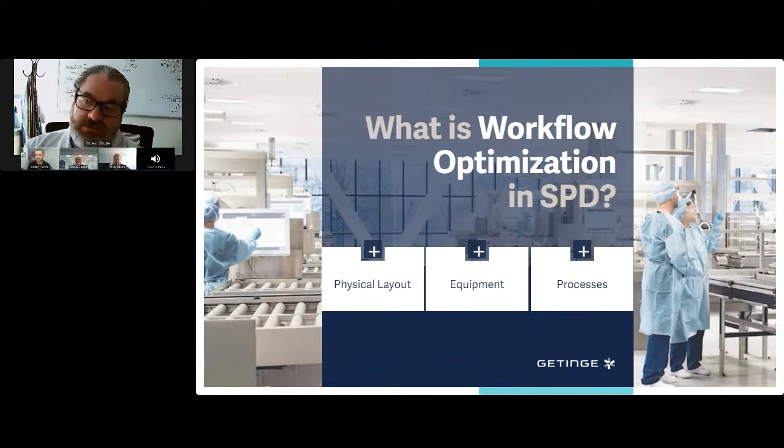So some of the ways we can do that: standard operating procedures, visual workplace, making sure those connections are clear, that we have feedback loops, and when something is sent, that we're also providing that information. And then lastly, and I think this links back to both physical layout and equipment, is making sure we have clear visibility and a physical layout that has adjacencies that make sense.